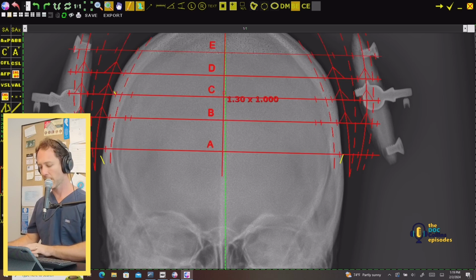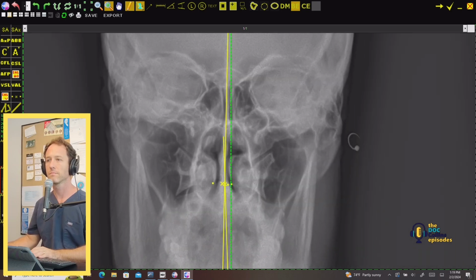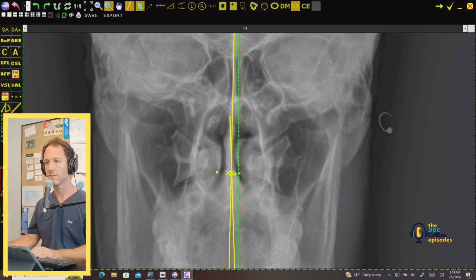So I feel good about that. All right. And then let's look at the atlas, right?